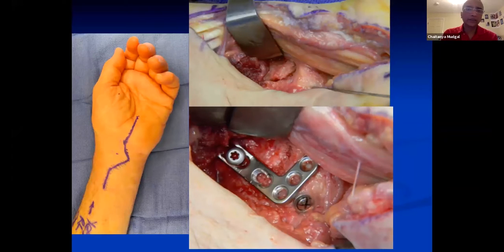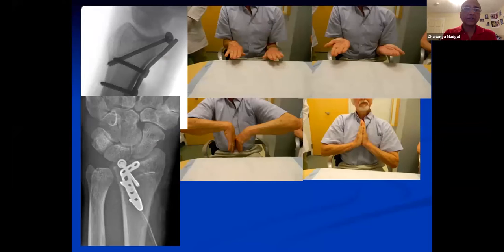A tip for the audience: to avoid cranking on the median nerve too much, make a large bolster and place it behind the hand — it reduces tension and makes retraction much easier. Oftentimes it's difficult to identify this fracture proximally, so you feel for the cortical break at the proximal ulnar edge, then develop this fracture and elevate it distally so that you can graft it.